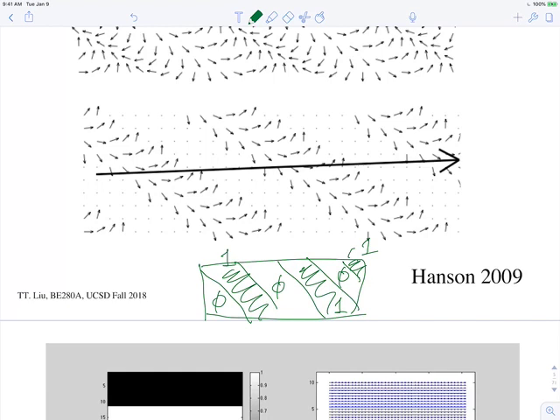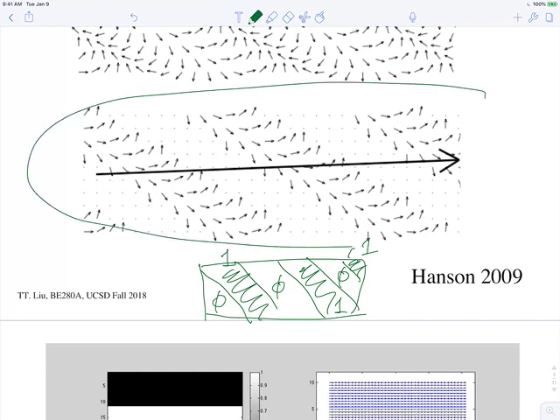So now when we apply the phasor pattern to this object, we're going to get something like this. Where there's no spins, the multiplication is implicit. There's no spins for us to do anything, so it's 0 times the phasor pattern, which is just 0. And where I had spins, and I assumed it was 1, then it's just the phasor pattern. By imposing a spin pattern onto my object, I'm actually doing that multiplication implicitly.